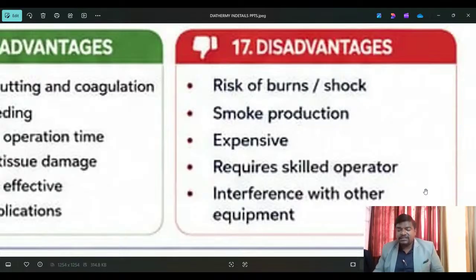And before touching the machine, without knowing anything, don't try to play with this equipment. When you connect the patient, then you should be careful. If you don't know, then please coordinate with your senior. Say, "Sir, I don't know, sir, please guide me." Then you have to take advice from your senior. Definitely your senior will help you, because we are all human. So definitely we are there to support and give good resolutions for the issues of medical equipment. I hope you understand my words.